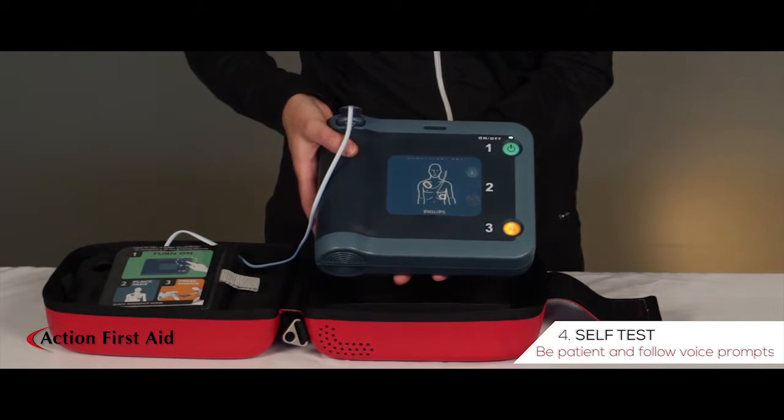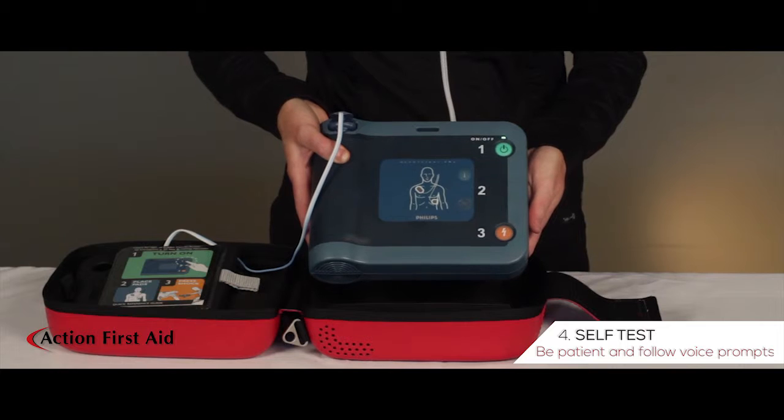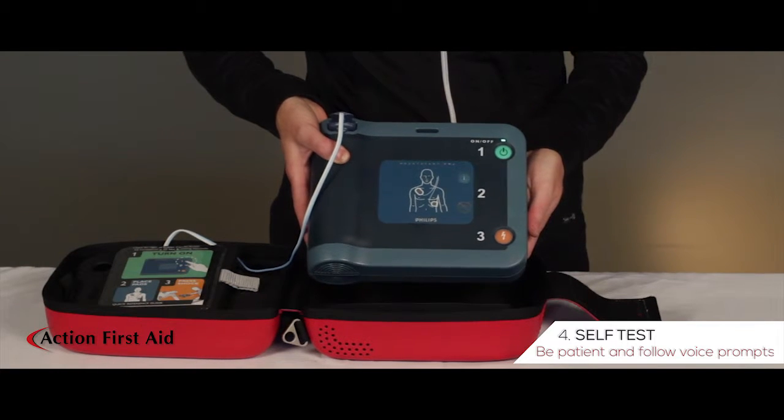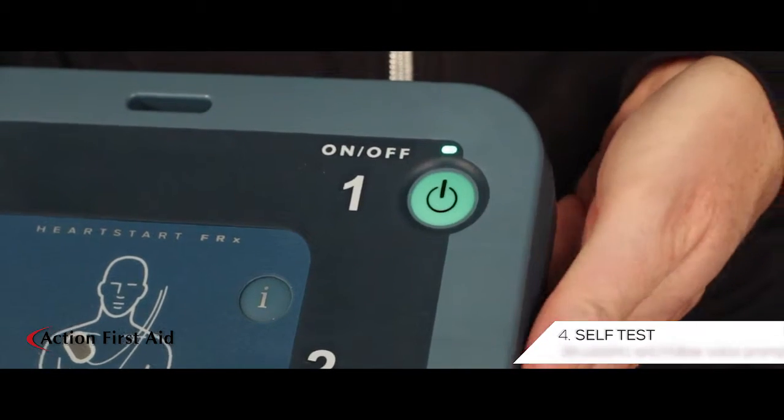Shock button test. If the orange button is flashing, press it. Verified. On-off button test. Press the green on-off button now. Verified.